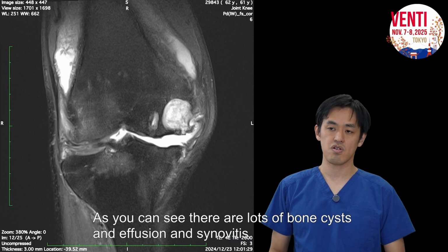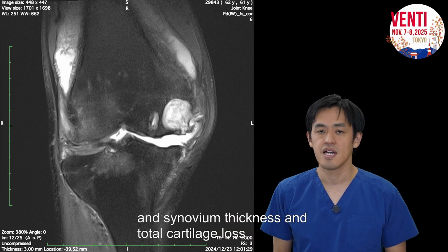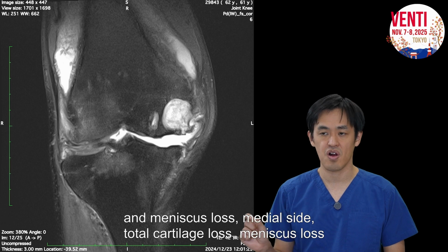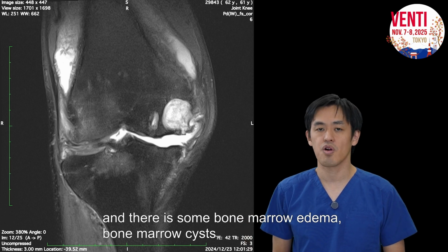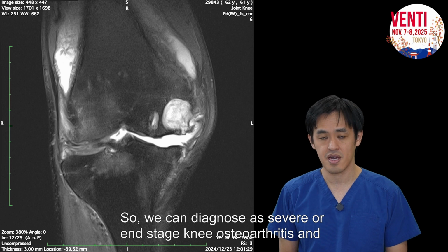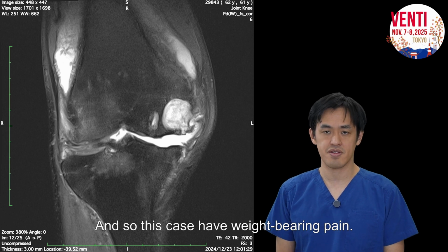As you can see, there are lots of bone cysts, effusion, synovitis, and synovium thickness, and total cartilage loss and meniscus loss on the medial side, and there's some bone marrow edema and bone marrow cyst. So we can diagnose severe or end-stage knee osteoarthritis, and the Kellgren grade will be grade 4. And this case has weight-bearing pain.